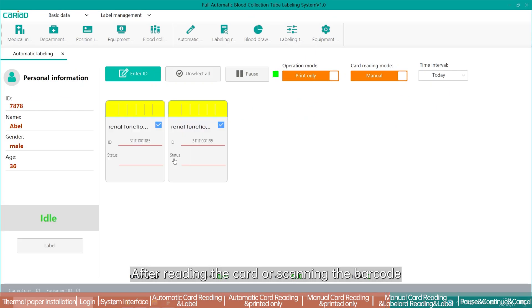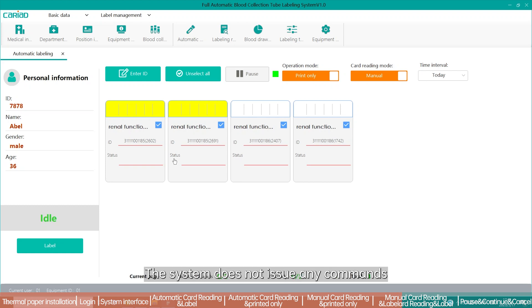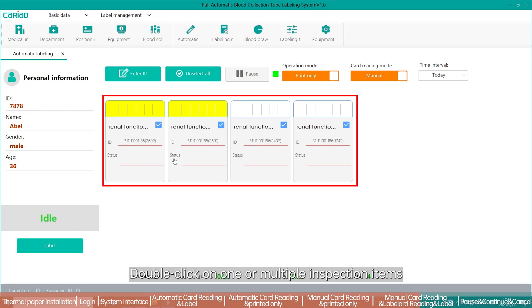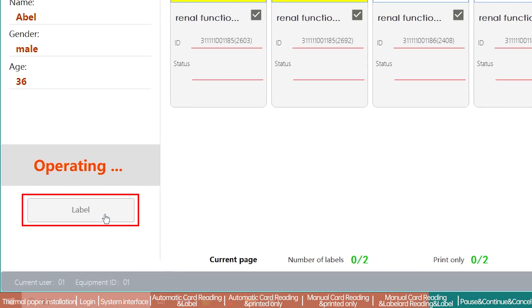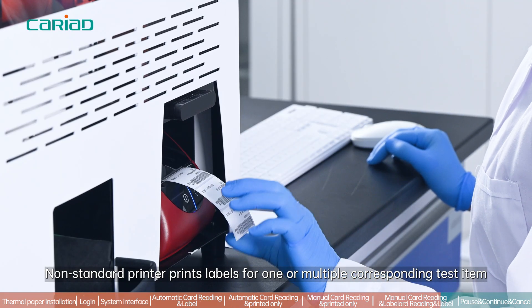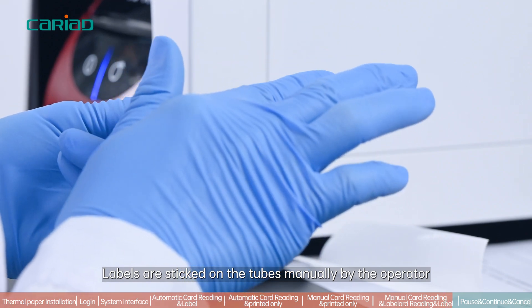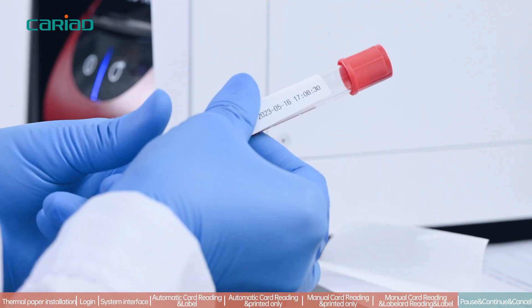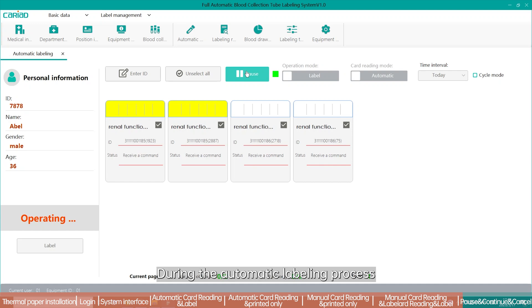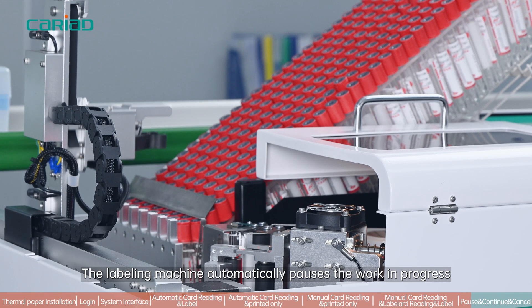In the mode of manual read and print only, after reading the card or scanning the barcode, each inspection item is shown on the operation interface but the system does not issue any commands. The operator manually double-clicks one or multiple inspection items, then clicks the label button. The non-standard printer prints labels for the selected test items, which are then affixed to the tubes manually by the operator.